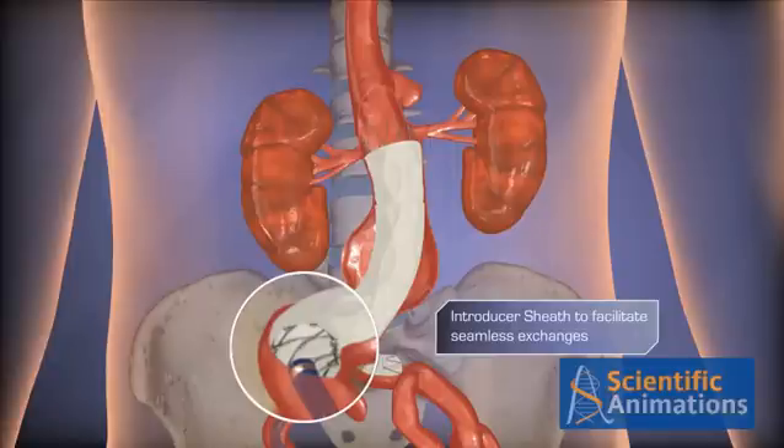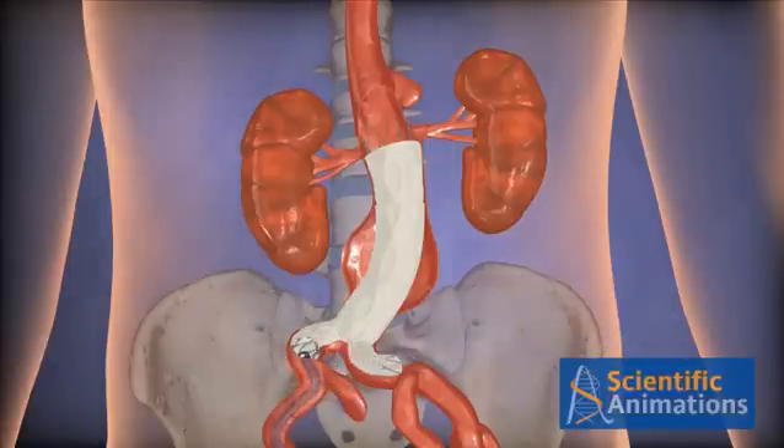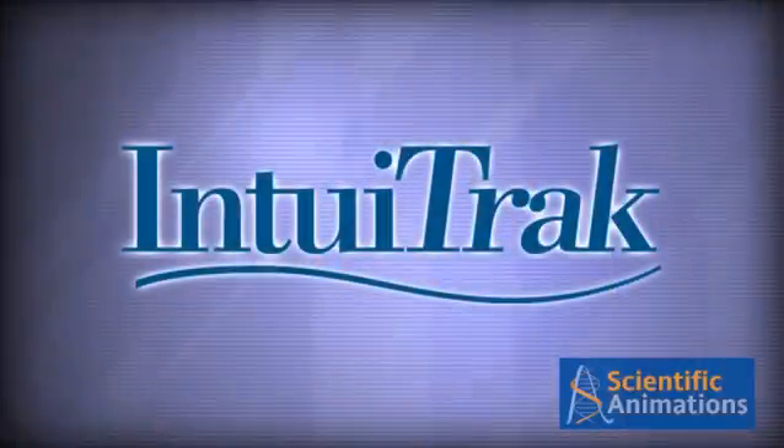The Intuitrack introducer sheath can maintain its position to facilitate additional accessory systems if necessary.